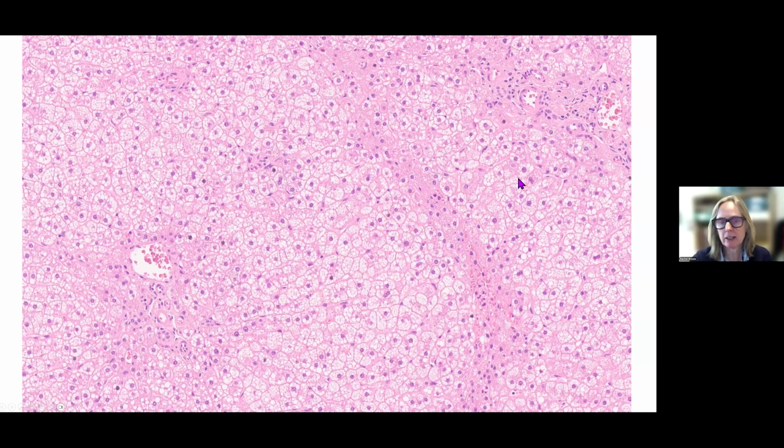Why are they pale? Because of steatosis. I've got a higher power again in a minute. Just another couple of these troublesome structures. Is that true portal tract or pseudo portal tract? I can't be 100% certain, but that for sure is an unaccompanied artery. There's another one there. So I do think that I'm in a lesion here.